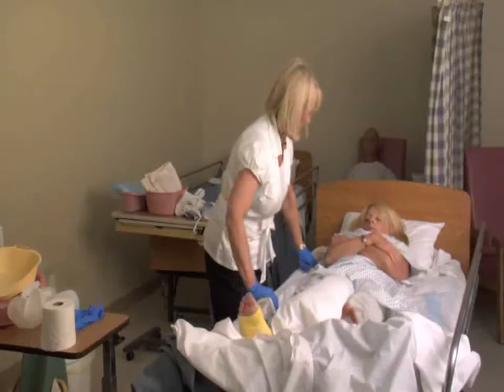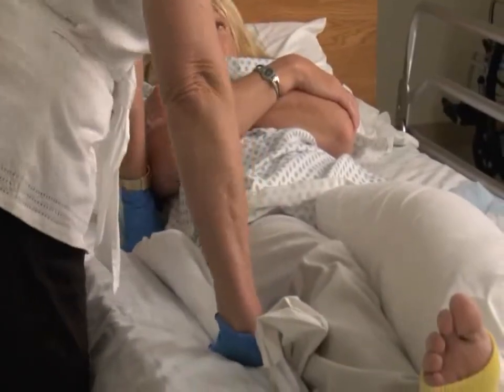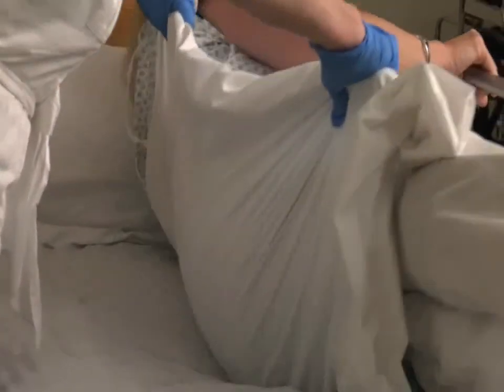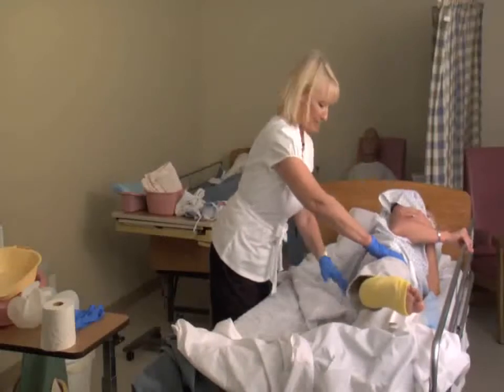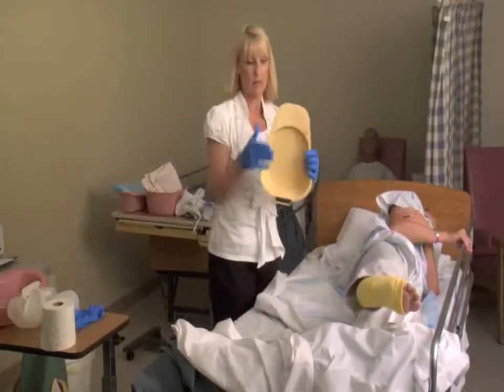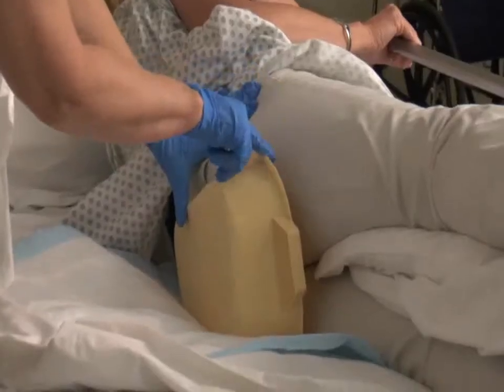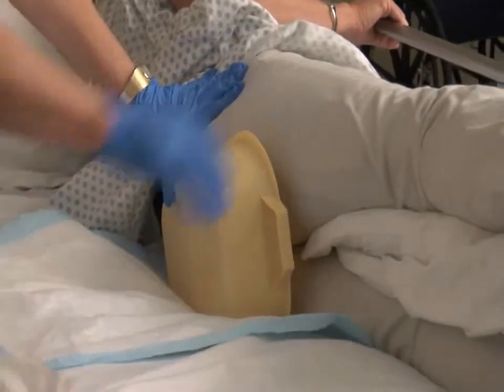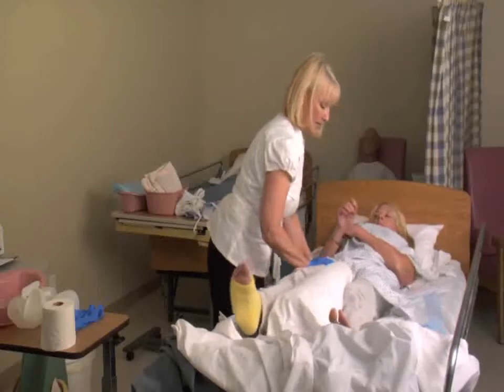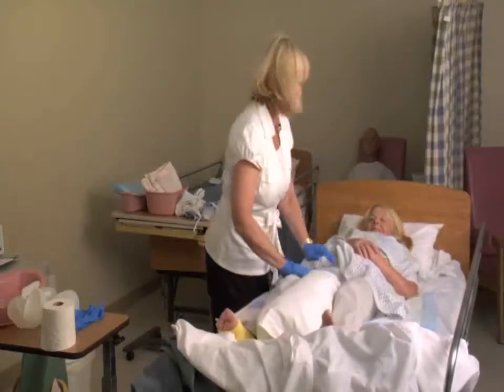I've got my draw sheet here. On the count of three, Mrs. DeBurke, we're going to roll to the side and I'm going to put the bedpan in place. One, two, three — over she goes. Perfect, she moved in one segment. I'm going to take my bedpan with this part at the top, and place it so we're not going to spill anything on the bed. On the count of three — one, two, three — back she comes. Then you just want to look and make sure the bedpan is in the right place, and it is.